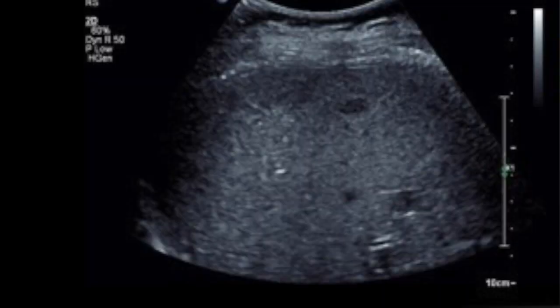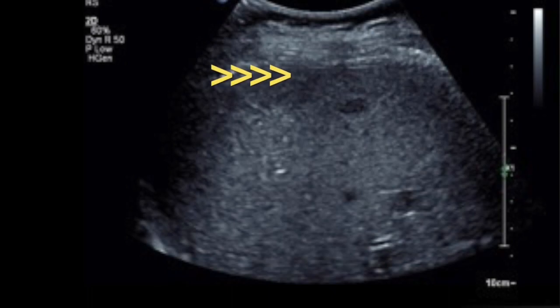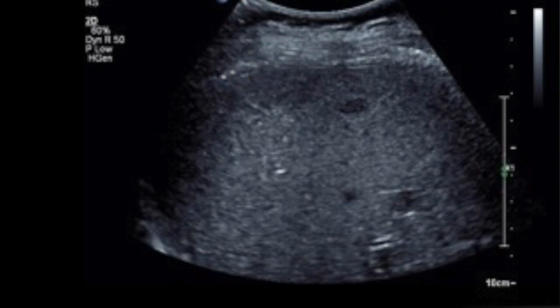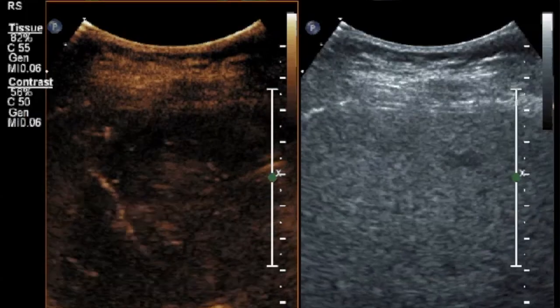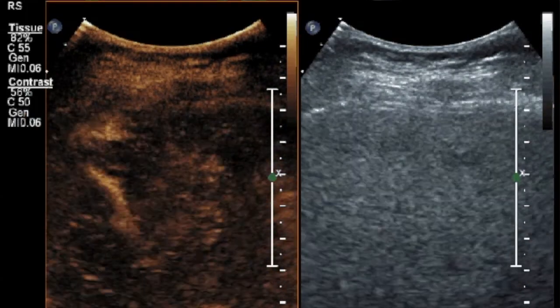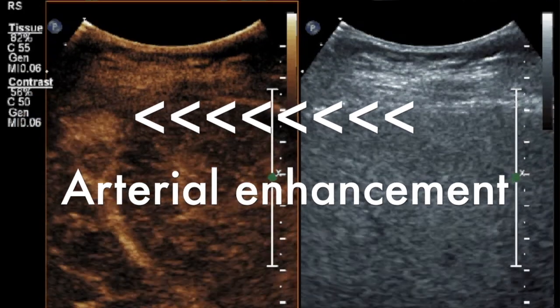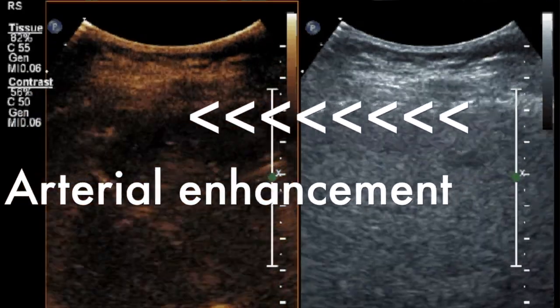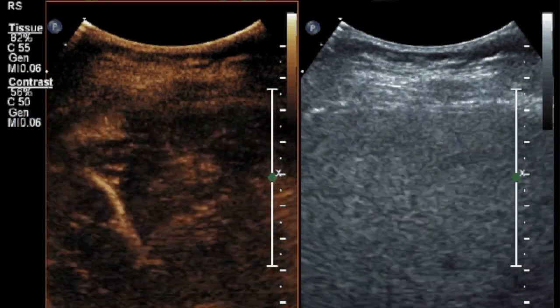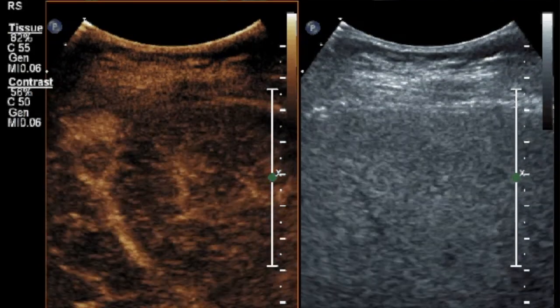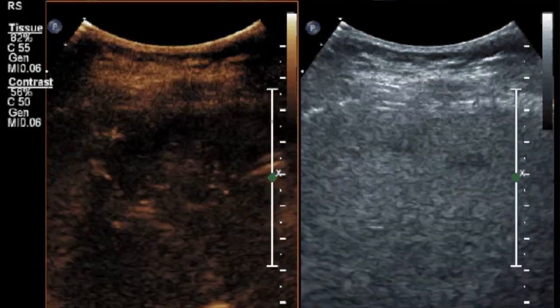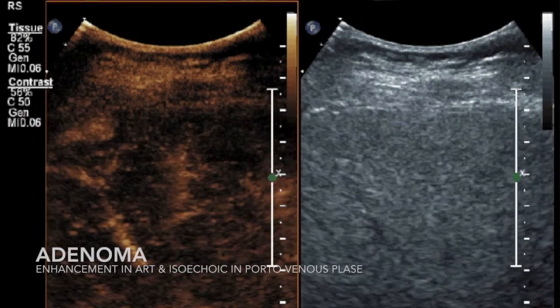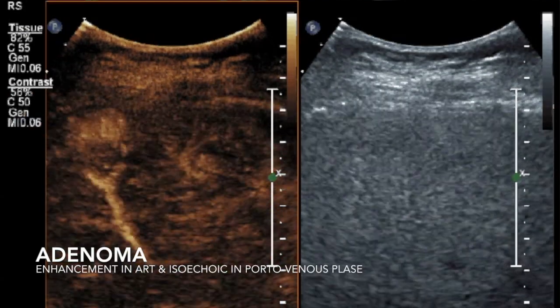Here was another patient where we saw an ill-defined hypoechoic lesion in the liver. We were thinking probably in terms of a fat-spared area, but we went ahead and did the contrast ultrasound and saw that this is actually showing arterial enhancement. There is enhancement of the lesion in the arterial phase and it is appearing iso-enhancing in the portal venous and delayed phases. So we came to a conclusion of an adenoma.